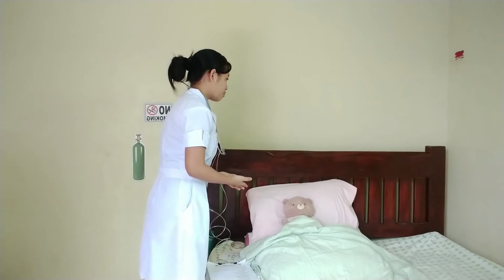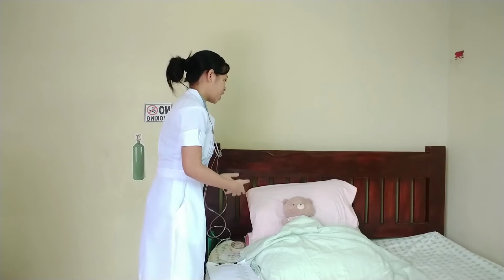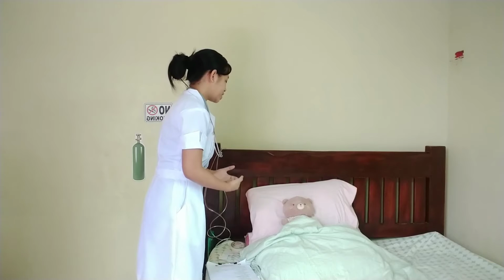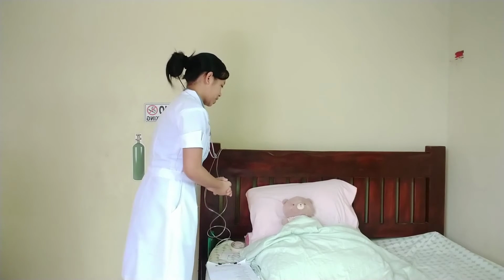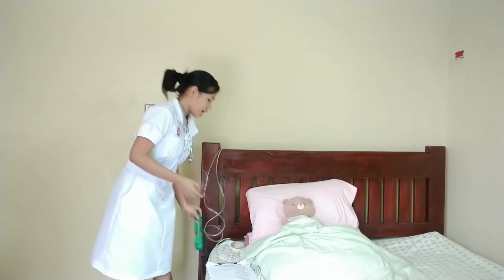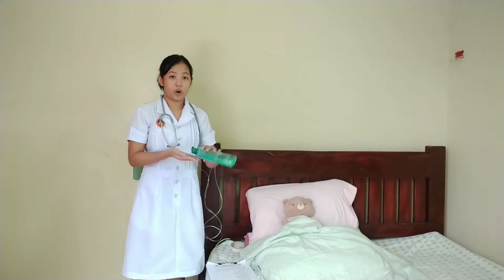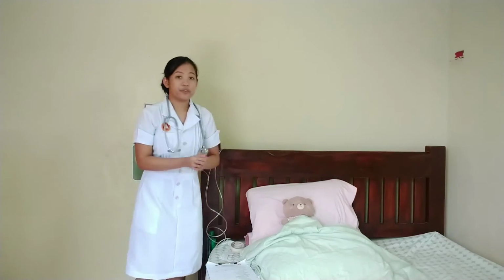And let me know if you are feeling any discomfort or any reactions once the oxygen is administered on you. Will that be okay, ma'am? Okay, ma'am, thank you. And then after that, I will now perform hand hygiene, and I will observe other appropriate infection control procedures. Also, I will be providing privacy for my client, so I will be closing the curtains around the bed and I will close the door of the room.